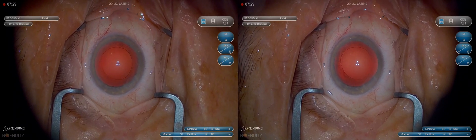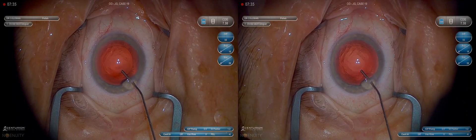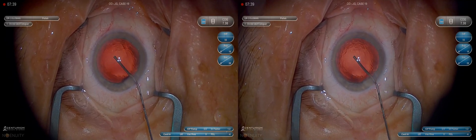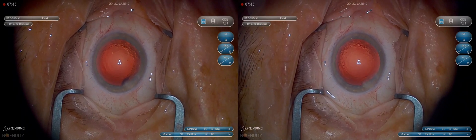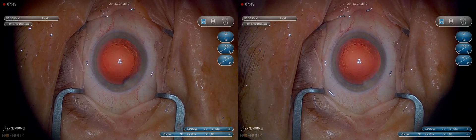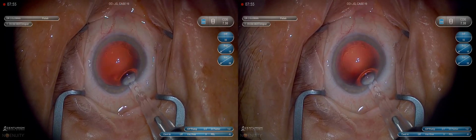When we're injecting ProVisc or our cohesive viscoelastic, we want to fill the bag first. Remember, you can't hit the posterior capsule with the cannula as long as there is viscoelastic actively being injected into the eye — it creates a fluid wave that protects the capsule. So we fill the bag first and then the anterior chamber. If we fill the anterior chamber first, we risk pushing the posterior capsule leaflet back and not getting a full capsular bag with space for the lens.